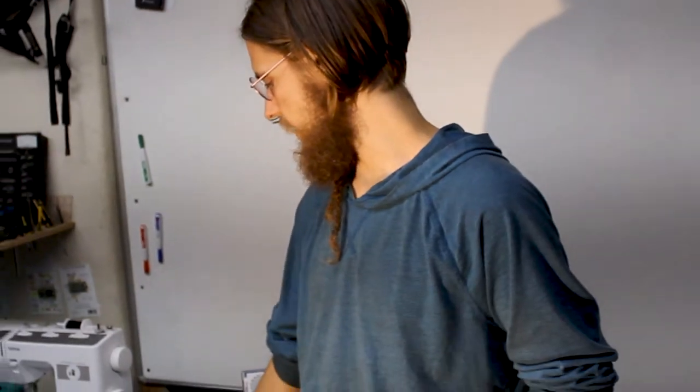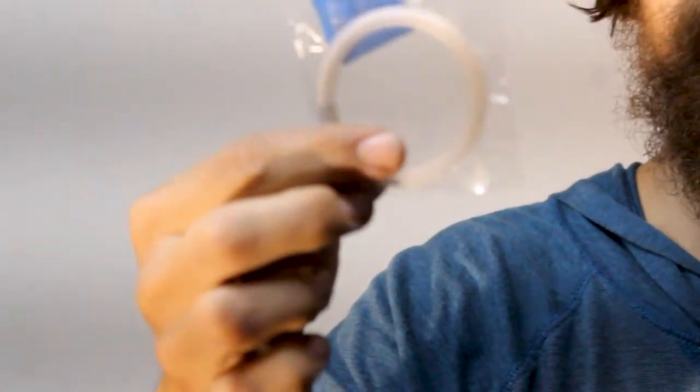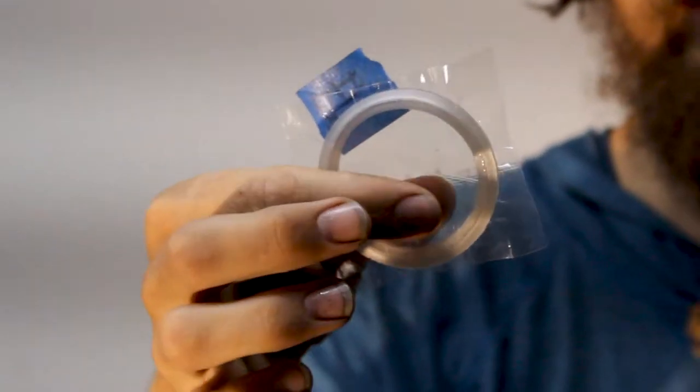Ideally, this would be something that anyone with a 3D printer can find some trash plastic that is stretchy and fill it with a fluid like oil or water, and have a pair of glasses, like emergency glasses. Probably not glasses you would wear every day, but if you're someone who can't really function without a pair of glasses, then it would definitely get you going.